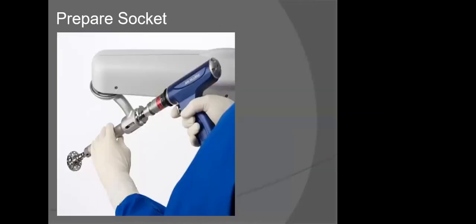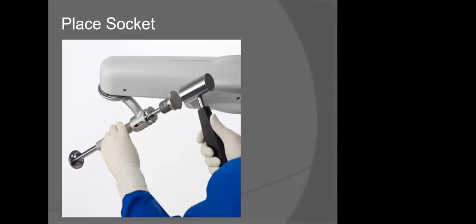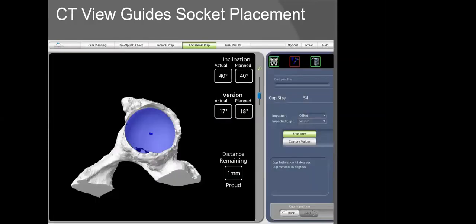This shows a typical end effector on the robot for polishing the socket to reestablish the normal center of rotation and optimal interface between the implants and the surrounding bone structure. This shows some of the workflow. This shows placing the thin titanium shell, which will also have a thin polymer lining on the inside, in optimal position with the robotic system in a schematic format. And this shows us checking the exact position of the components.